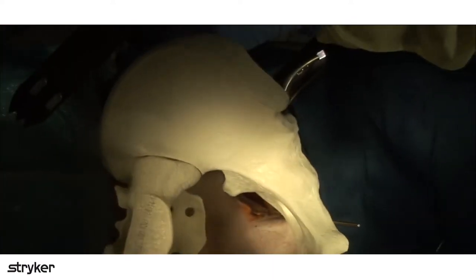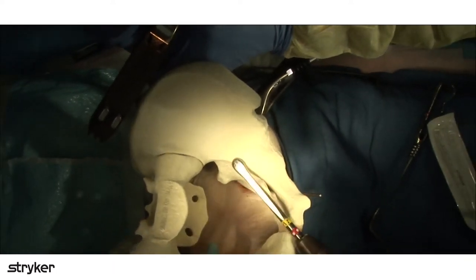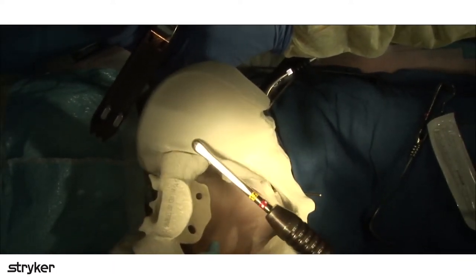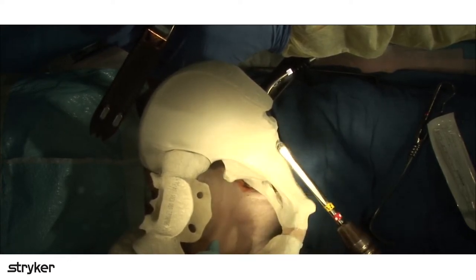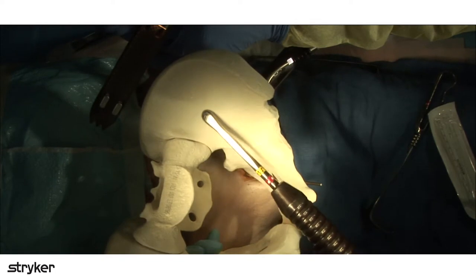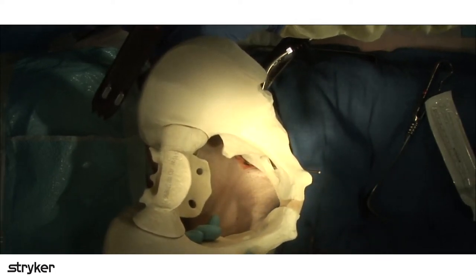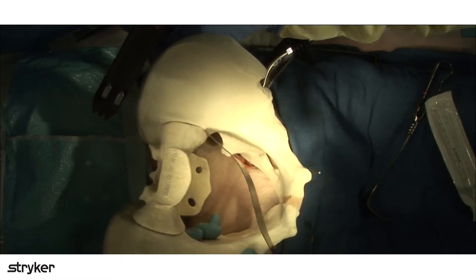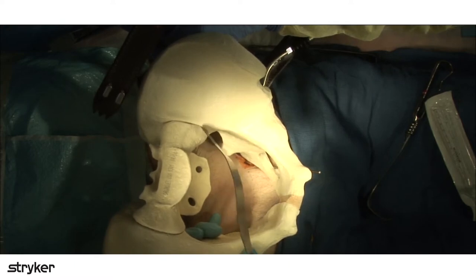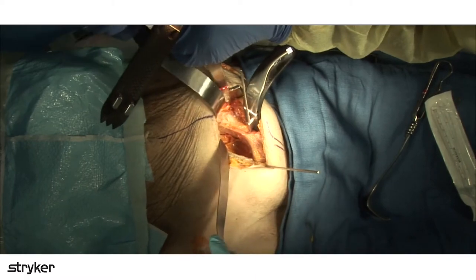Thanks. So basically that cob in this retractor, we're going to come here, and we're coming up just lateral to the sacroiliac joint like this. And this is basically what we're exposing right here with this AIP approach. So this malleable retractor is going to come right to the front lateral portion of the SI joint and push the pelvic contents away. So this is going up and in, and that is coming right there.